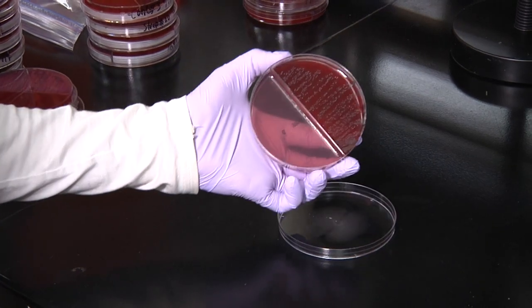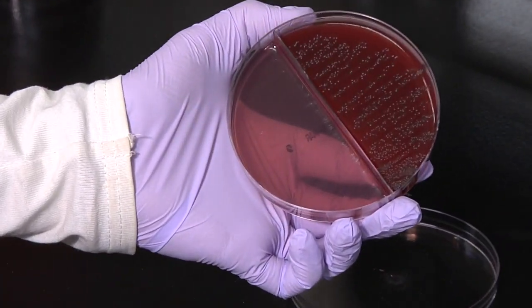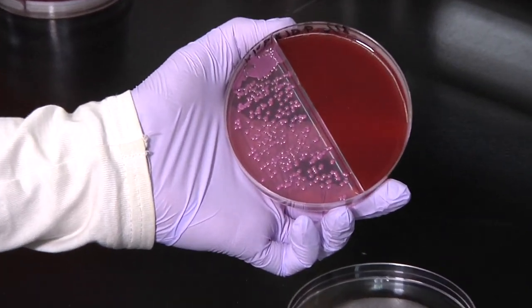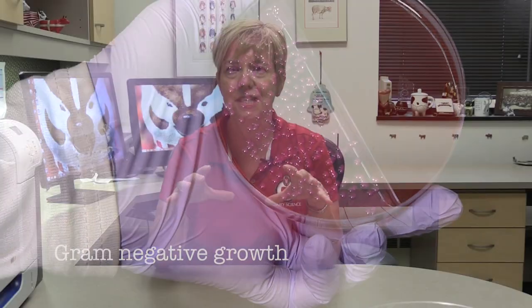So let's say we have less than three different types of colonies. We now are looking at the plate and trying to make a diagnosis of if we have a true intramammary infection. And these true intramammary infections usually have greater than five colony-forming units on the plate. And here we're showing you a couple of examples of excellent growth. We've got a biplate that has solid growth of a gram-positive organism, so many colonies on the red side. And we've got another biplate with solid growth of a gram-negative organism. In both of these instances, we've got one colony type, and we're very confident in reaching a diagnosis of our mastitis pathogen.